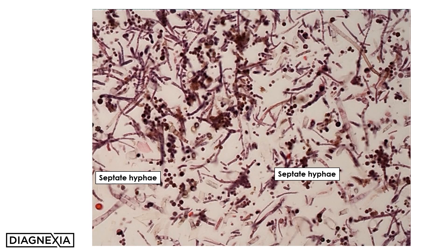The hyphal forms are clearly septate and vary in size and shape. The more degenerate ones appear slightly bloated and devoid of septae. The spores are also variable in size and shape and deeply pigmented.